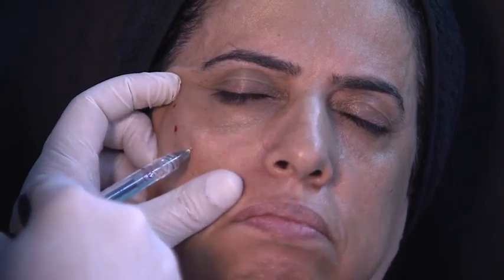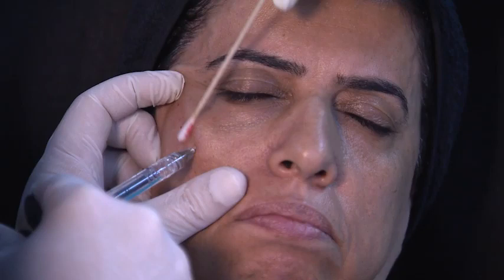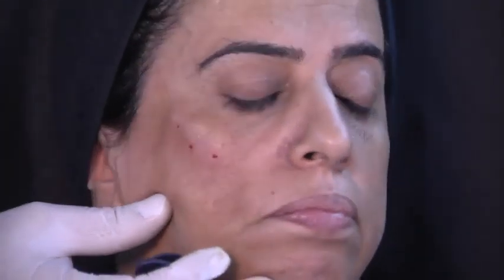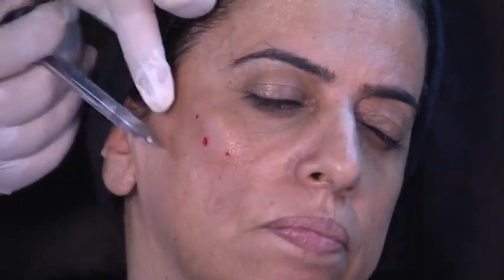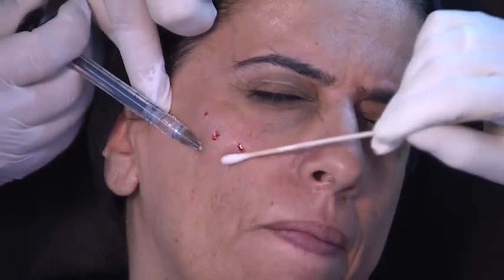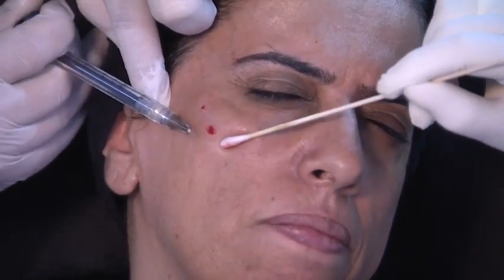Right. So now, can you stay like this? Third point, point of maximum projection. That's my third point. 0.4 here. We need to create some structure. And I will leave 0.2 for the other two. Look at that exaggerated nodule. I now mold towards the lateral part and we're starting to create, okay, the shape of the bone.